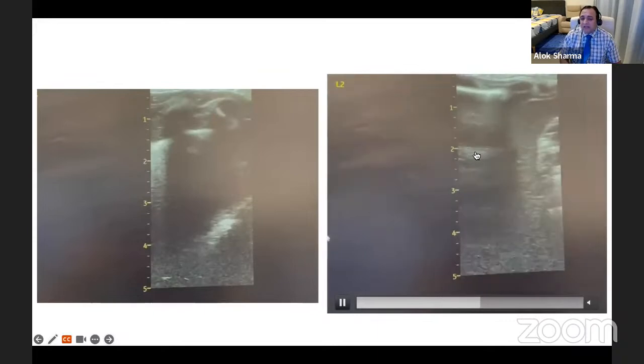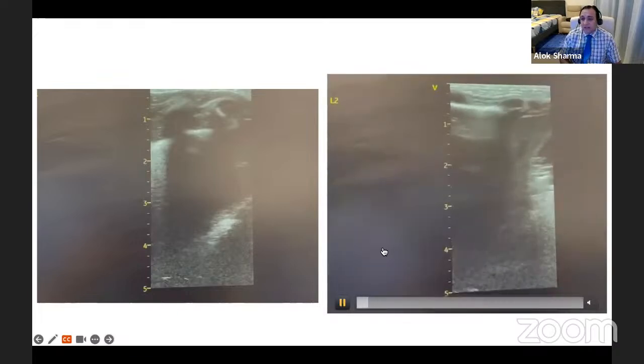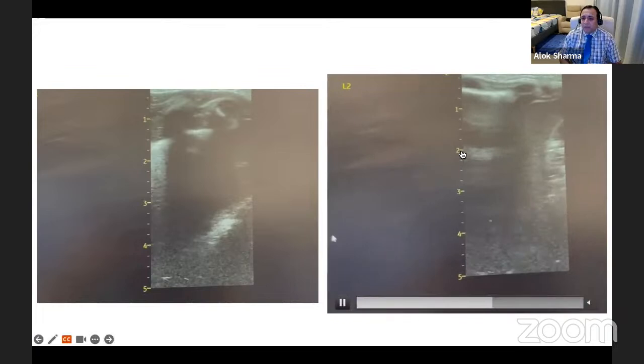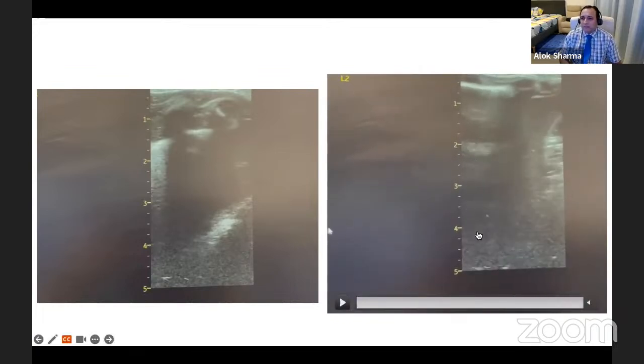It's fantastic to see the progress of the case over time, and that meconium aspiration takes a long time to heal. Clearly you'll find you have different patterns over a period of time. But what you can see here, and I think if you'd seen Naz's images, you had a very, very dominant B profile in that. Whereas here now you can see patchy aeration of the lungs.